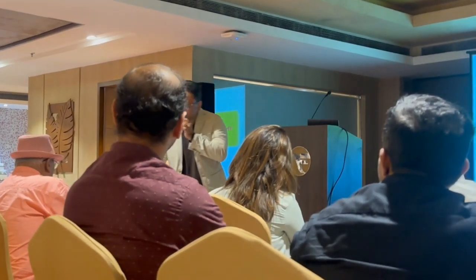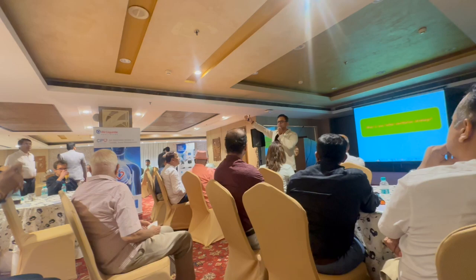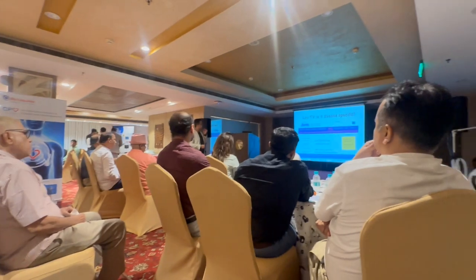So it really doesn't matter whether it's ARDS or no ARDS? No, it doesn't matter. How many of the people in the house believe it has to be always low tidal volume, irrespective of ARDS or no ARDS? Whether you're dealing with normal lungs, healthy lungs, diseased lungs, how many of you believe? Good numbers. And how many of you believe no, if it is not ARDS, you give around 8 to 10 ml per kg, which is a good tidal volume? No one? Okay.